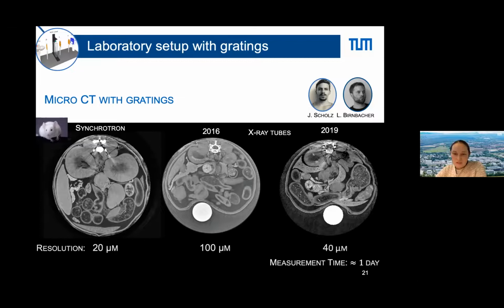So everything below 40 or 50 kV peak works fine. And then there is a gap up to the absorption edge of the gold, which is around 80. And after that, you again have good visibility of these gratings, up to maybe 80 to 100 to 120, and then it's again dropping.